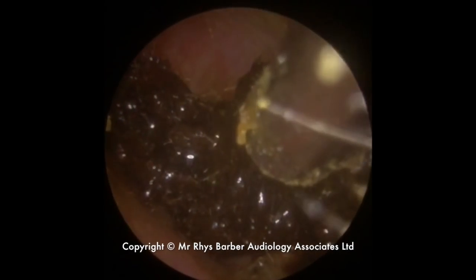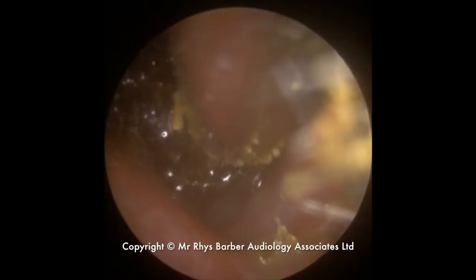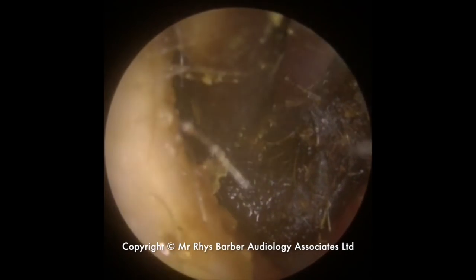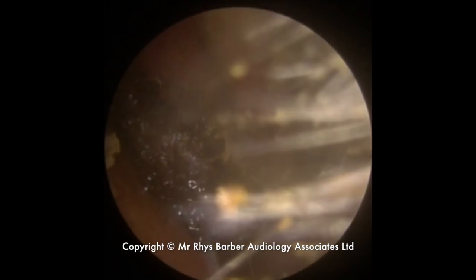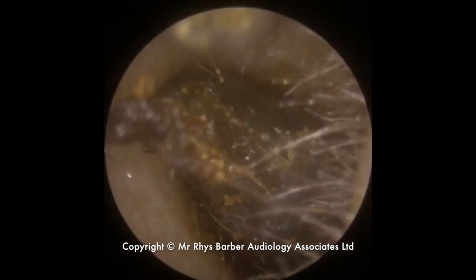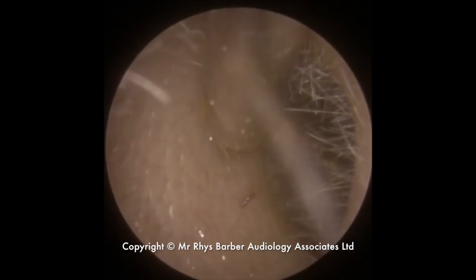We'll just put a little bit of olive oil in, same reason as before — just to reduce some of the adhesion. You can see it's still stuck to the canal walls there. The olive oil forms almost like a lubrication around the edge of the ear canal, so not only does it reduce the stickiness, but it helps us to slide that wax across the skin. You can see we've got an end of wax here just protruding from the canal.